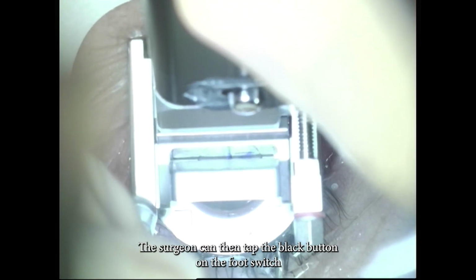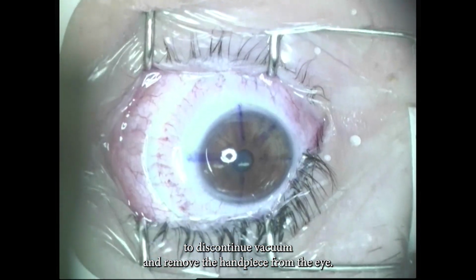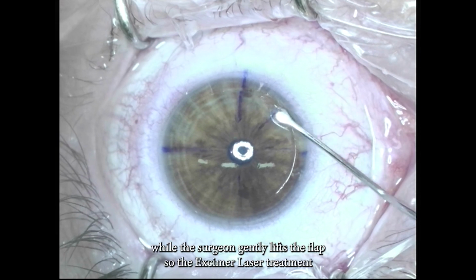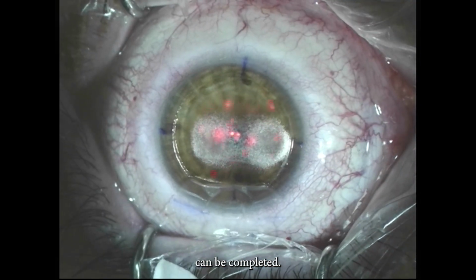The surgeon can then tap the black button on the foot switch to discontinue vacuum and remove the handpiece from the eye. The surgeon can then pass the handpiece to the surgical technician while the surgeon gently lifts the flap so the excimer laser treatment can be completed.